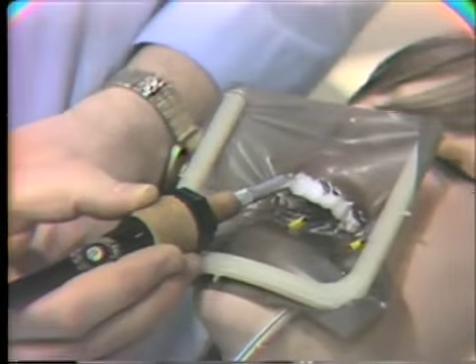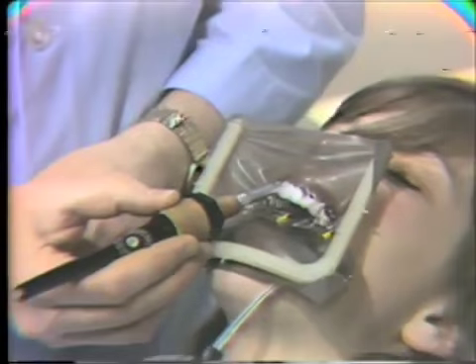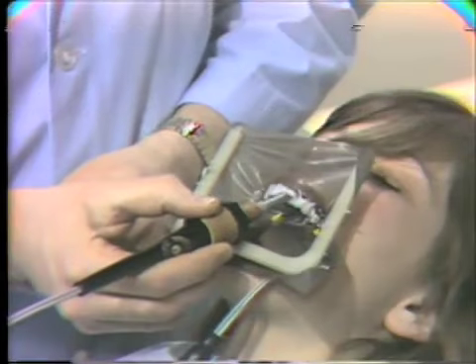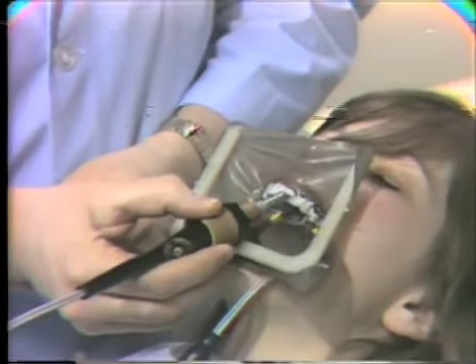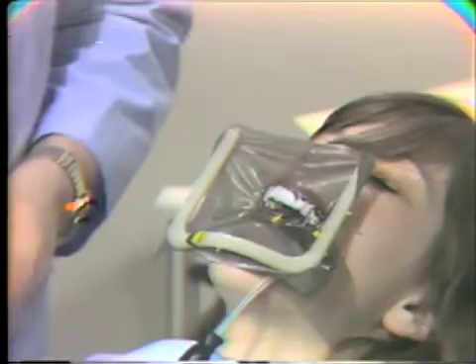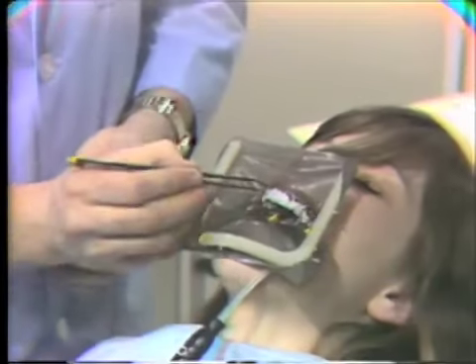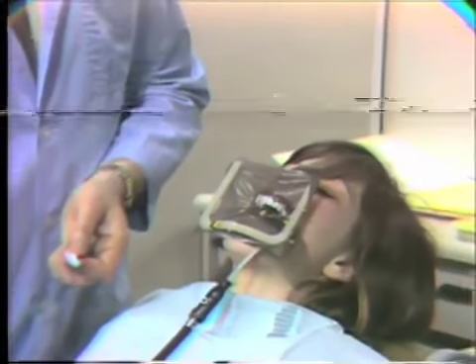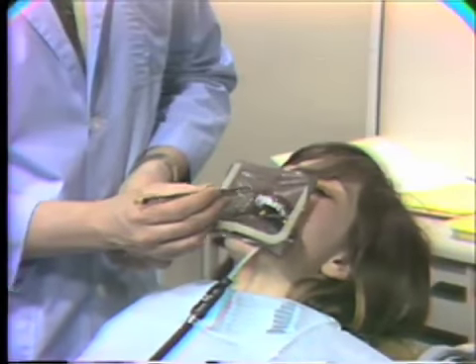And during those 3 appointments, we work for about 20 minutes in this manner, going from tooth to tooth, applying heat. Now, usually about every 5 minutes, what we'll do is stop, take the cotton that has been previously saturated with superoxol off of the tooth, dry it, a small piece of cotton, and then add some fresh superoxol to that piece of cotton and put it back on the tooth again.